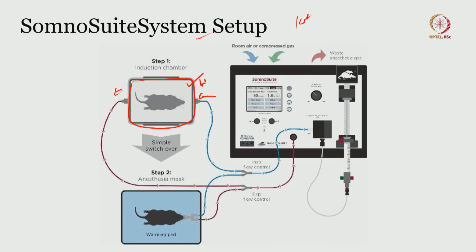All right. So the inlet actually delivers the gas, which the rat inhales and then goes to an unconscious state. That depends on the onset of action of that particular drug, and on the body weight of the rat. All right. So once that induction happens, you then switch to the actual behavioral setup or the experimental platform where the surgery will be performed.